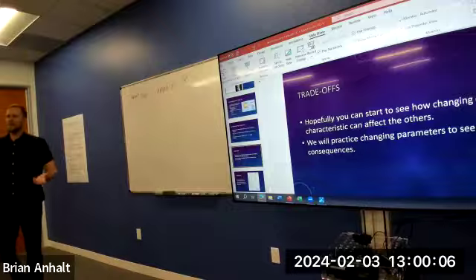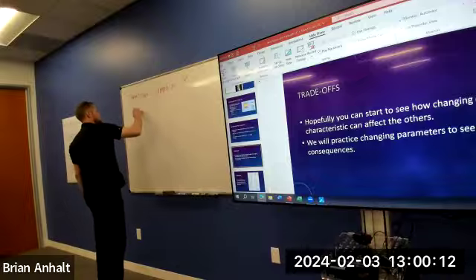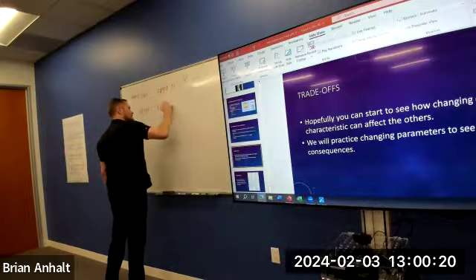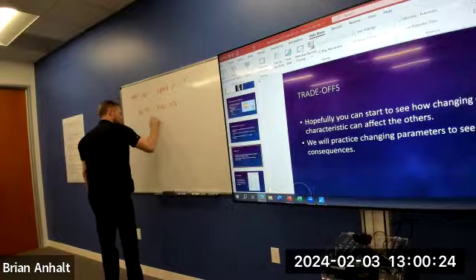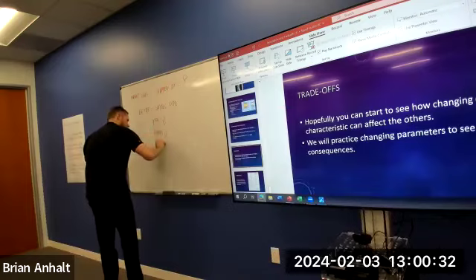That's probably going to give me worse SNR, but how do I get better resolution? Matrix. Smaller boxes. Better resolution equals smaller voxels. And how do I get that? Field of view down, matrix up, slice thickness down, right?